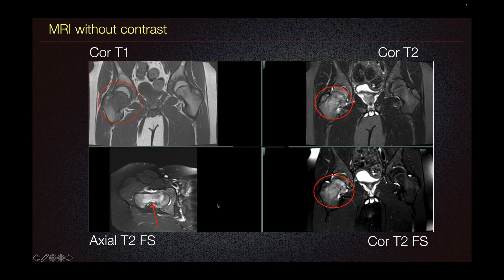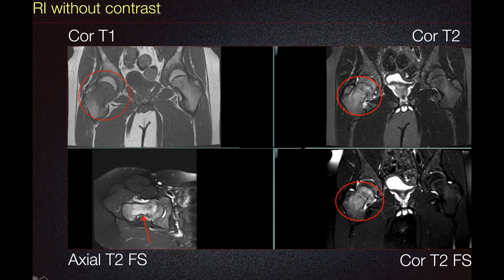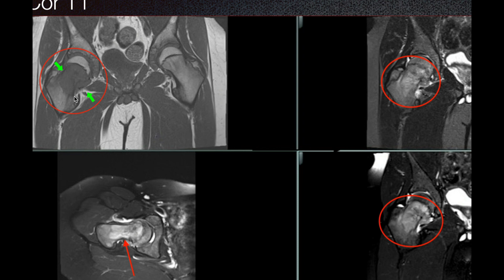The patient then underwent MRI without contrast. Here on our coronal T1 imaging, we can see this mass that is isointense to the surrounding muscle with surrounding soft tissue component. On our coronal T2, we can see this heterogeneously T2 hyperintense mass within the right femoral neck correlating to the findings on our T1.